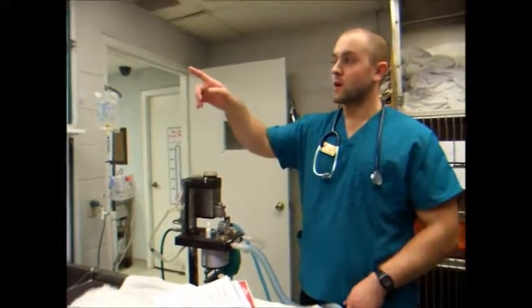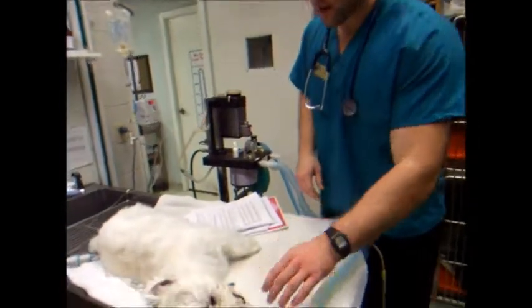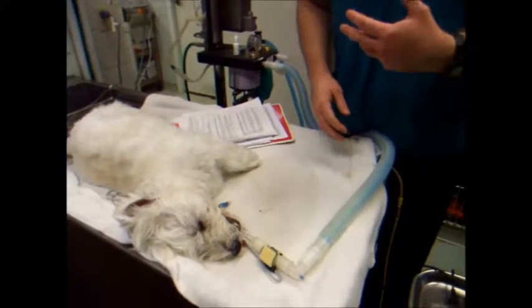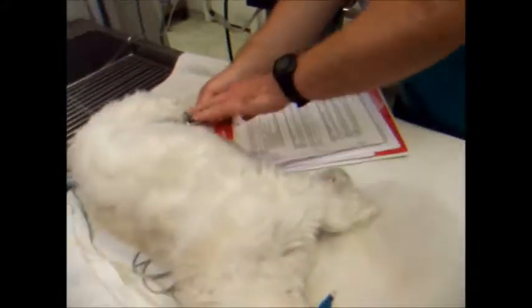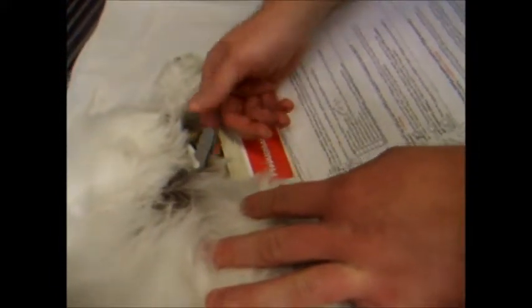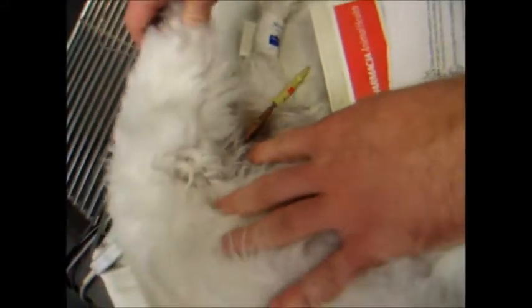Okay, I'm going to go over our Cardell machine here, and all the aspects of it. What we've got here is our CO2 reader. This monitors the inhalation and the exhalation of CO2. We've got our pulse oximeter here, measuring the SpO2, or the oxygen in the blood. I've got it on his penis right now. I've got my ECG monitors here. That obviously monitors the heart rate.